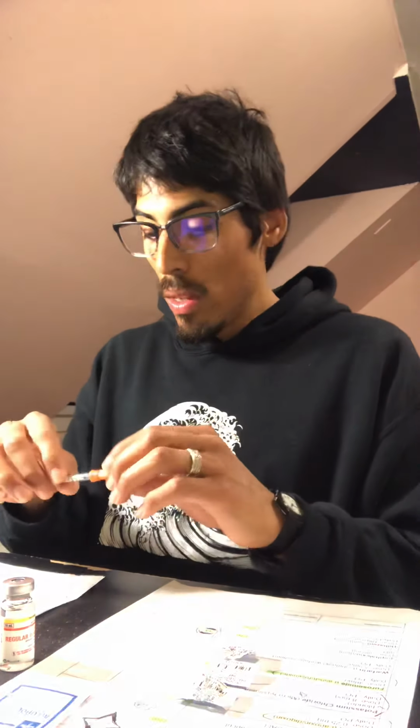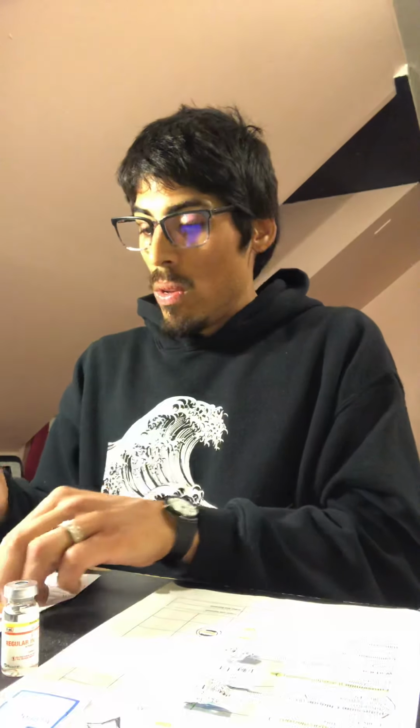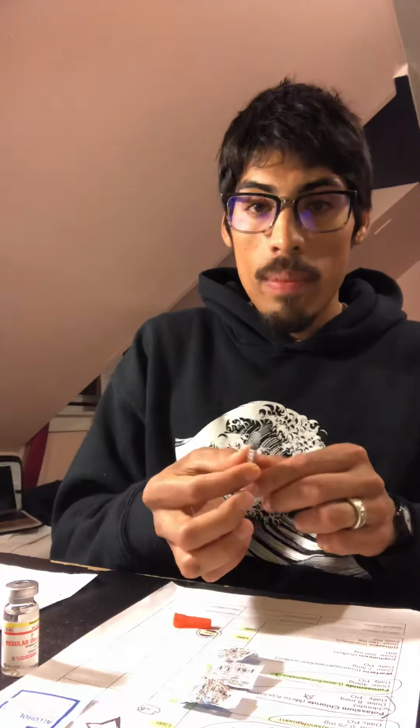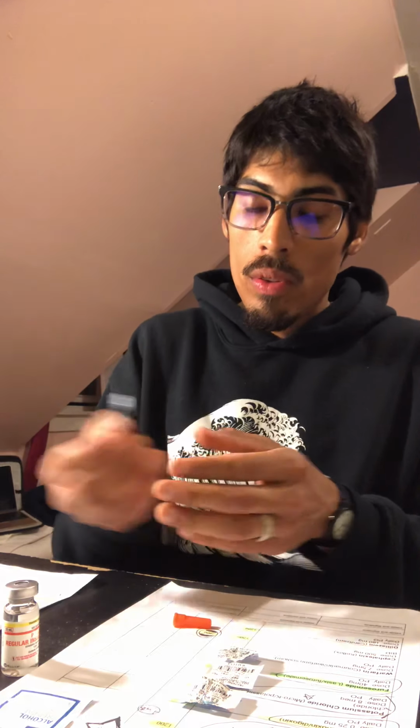Now we're going to go ahead and wipe the top of the insulin, clean it off. You want to wait for that to dry. You want to open up your insulin syringe. You should have drawn the air when it was closed, but draw the air, 4 units.